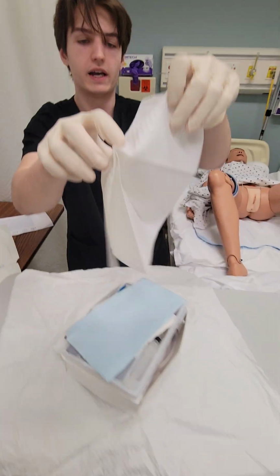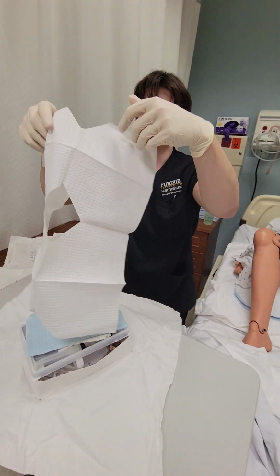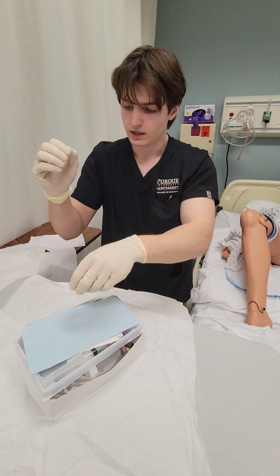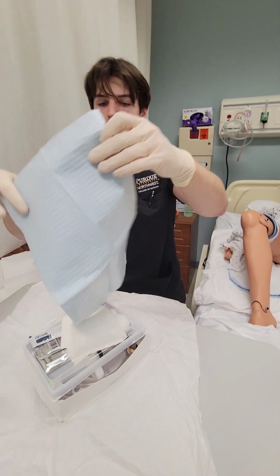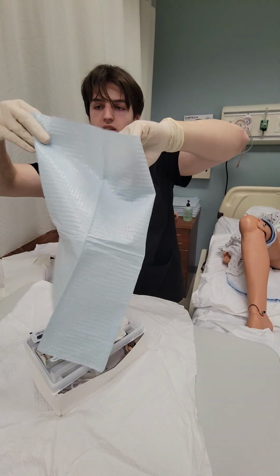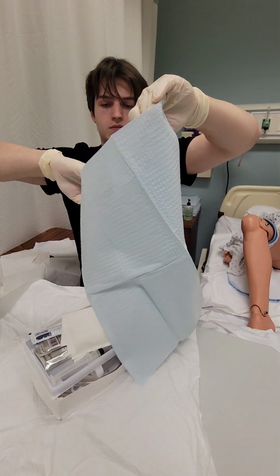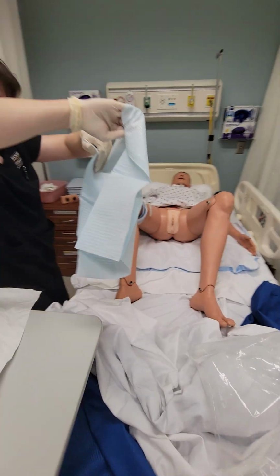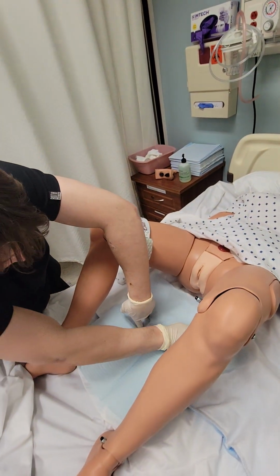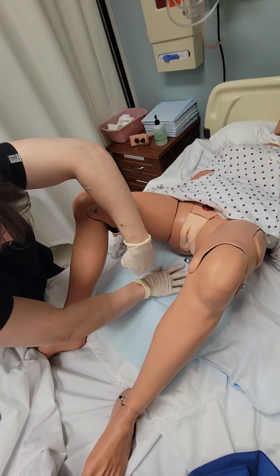Alright, so it looks like here I have the fenestrated drape. I will not be using this today. As per hospital policy, it is not required. So now I'm going to pick up this drape. The shiny side will be down. Try and tuck it under.